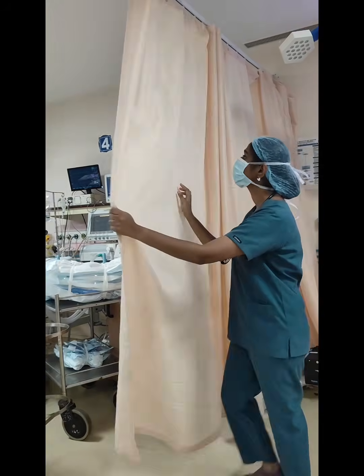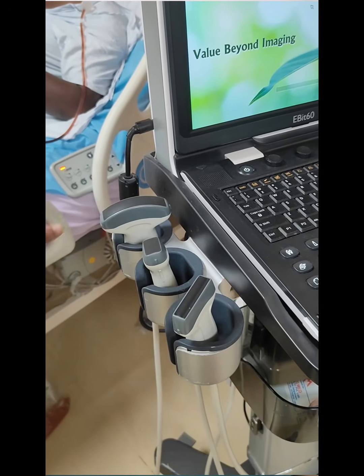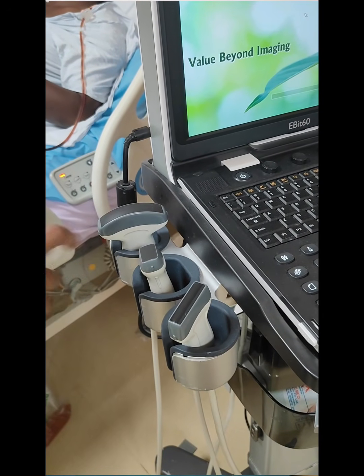Let's begin with proper hand hygiene. Ensure patient's privacy. If the patient is fully awake, make sure you get at least verbal consent before you perform the ultrasound. Then select the appropriate probe. I use a linear probe for checking optic nerve sheath diameter, lung sliding, and DVT scan, and I use either a curvilinear or phased array probe for checking IVC, diaphragm, effusion or bladder.